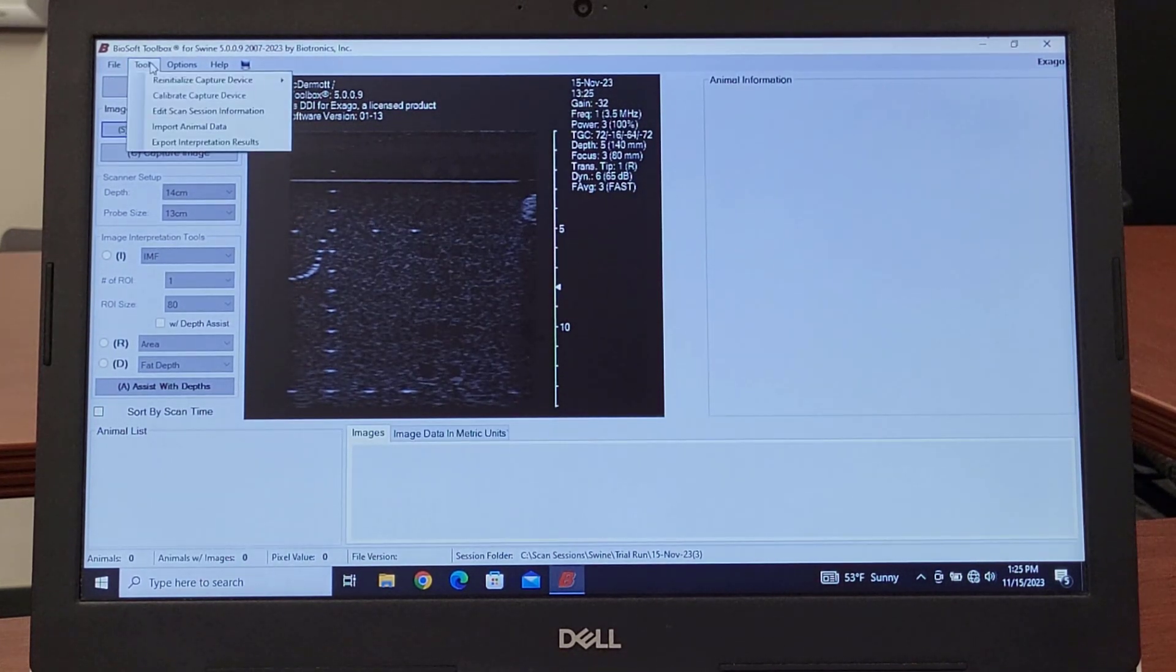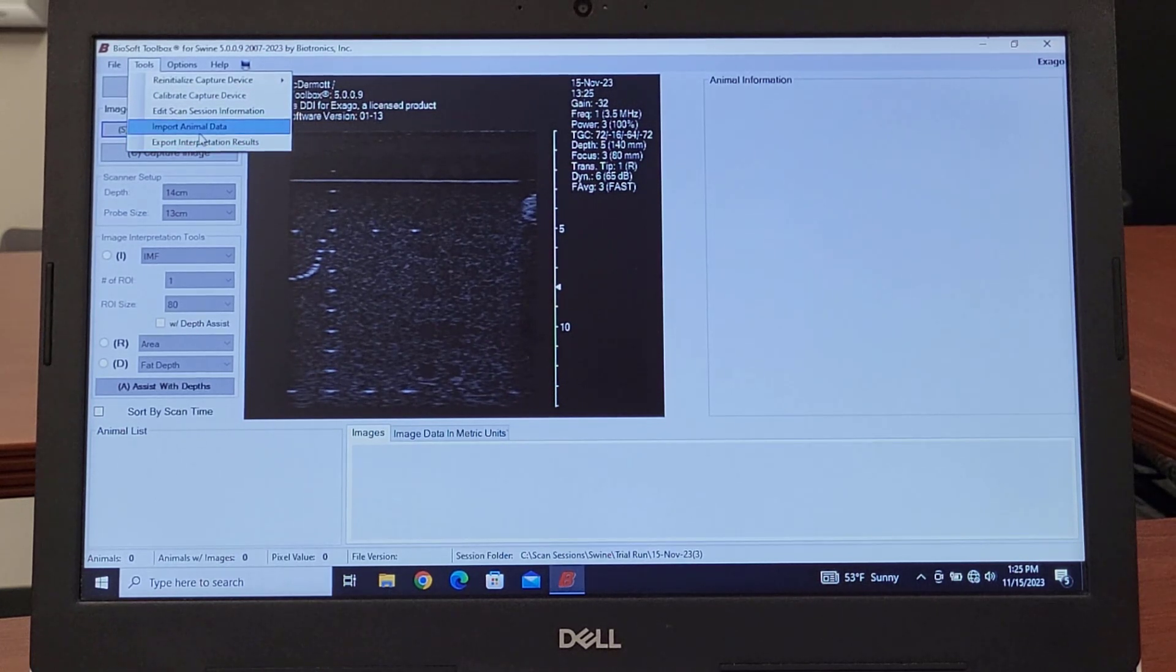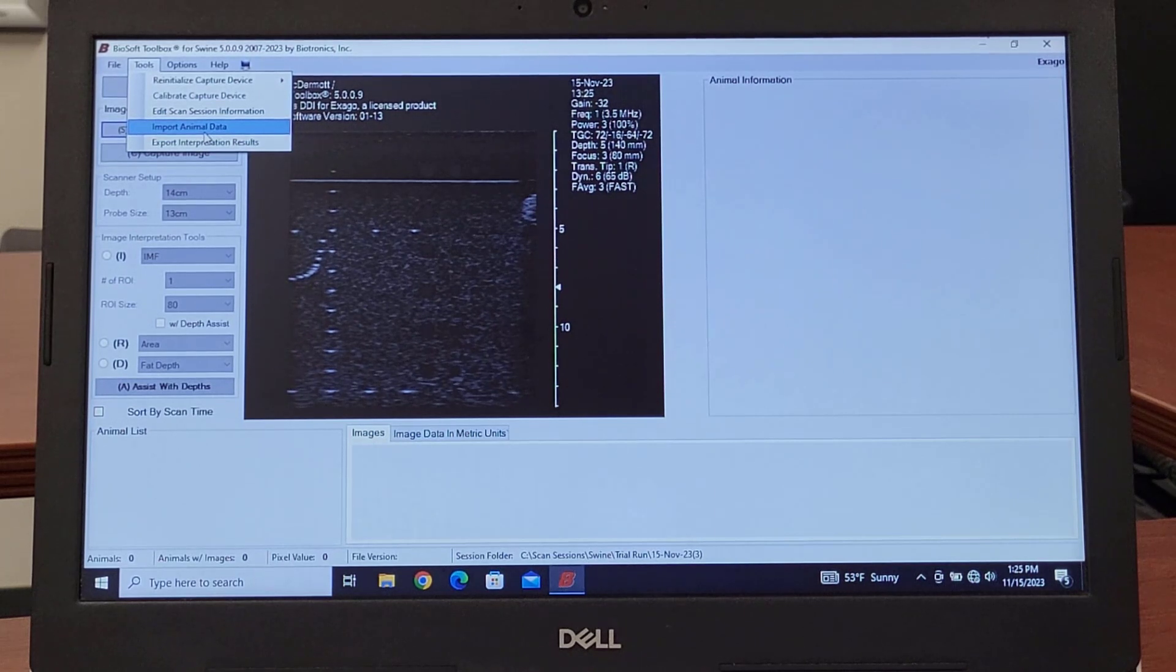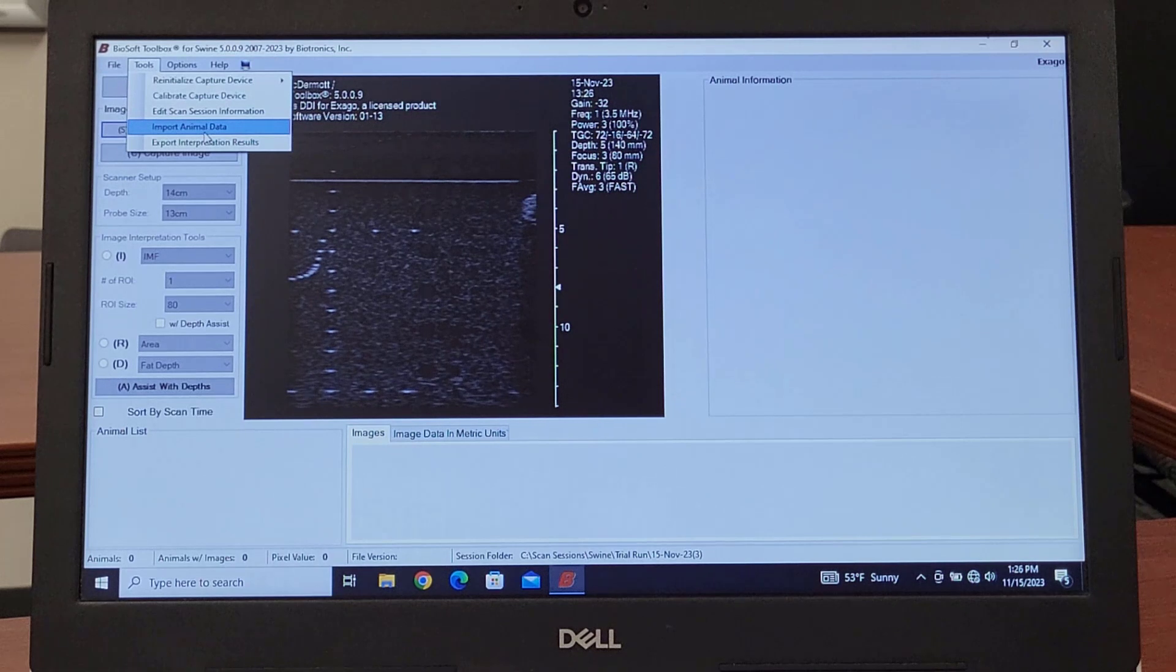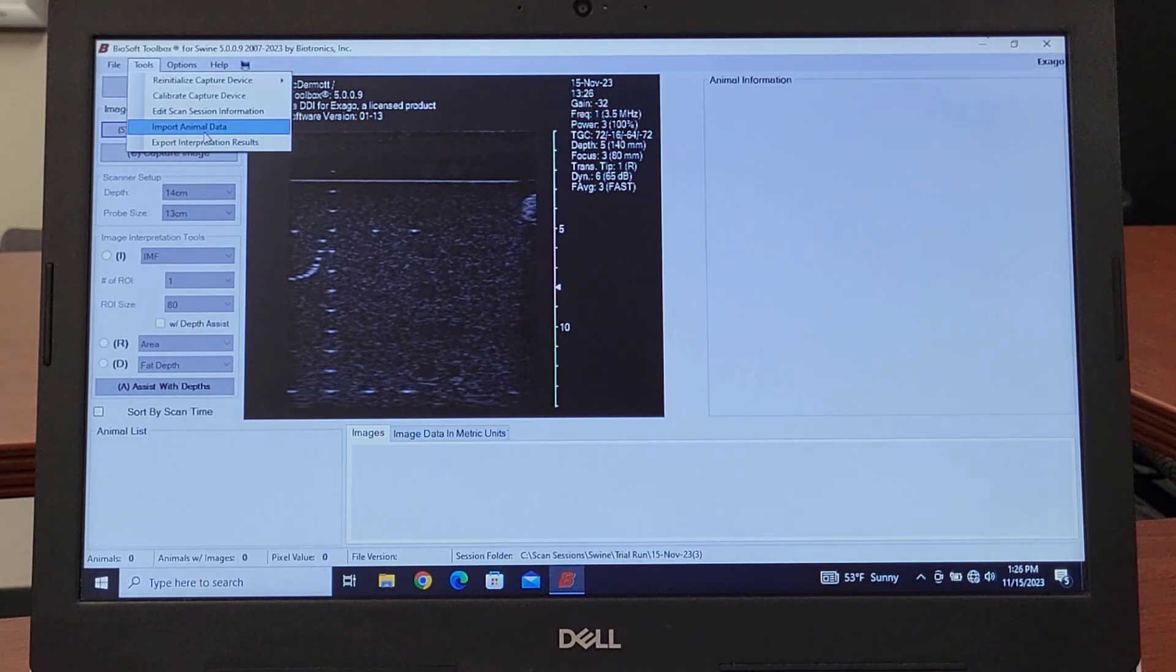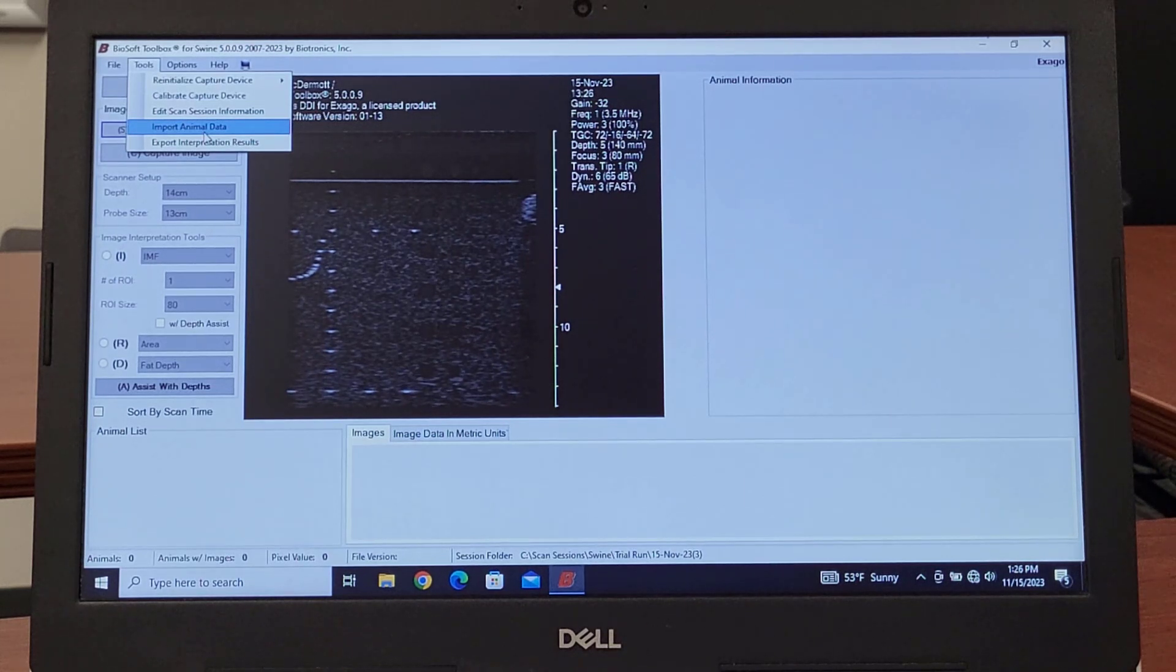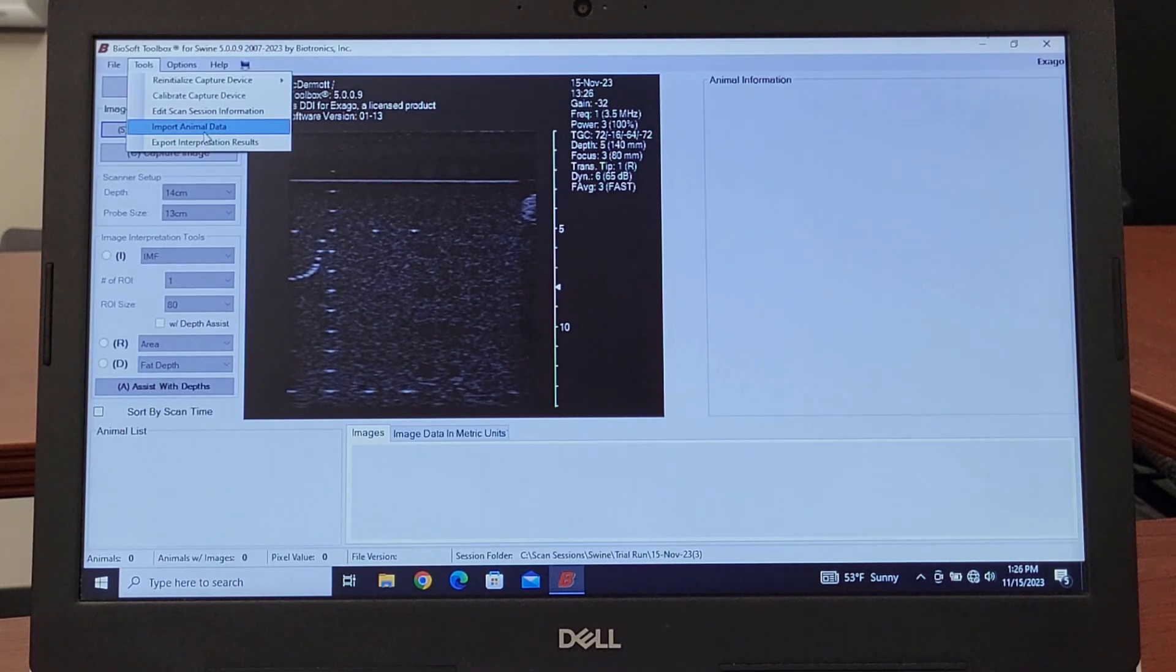The last thing on the list here is Import Animal Data. In some cases, producers like to have data preloaded into the program to make sure that it matches IDs that were used in the past. Say if you're doing a serial scan and you want to make sure or just eliminate the need to be typing in, making sure the pen number is right and making sure the sex is right, it's already been put in once.